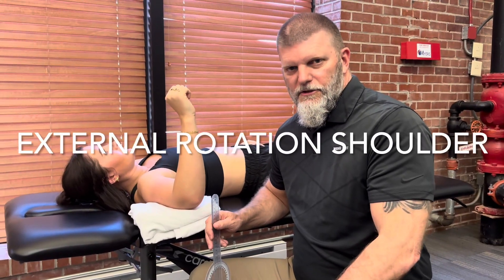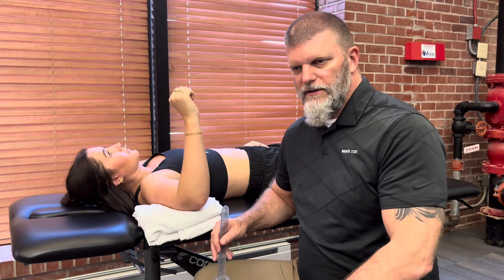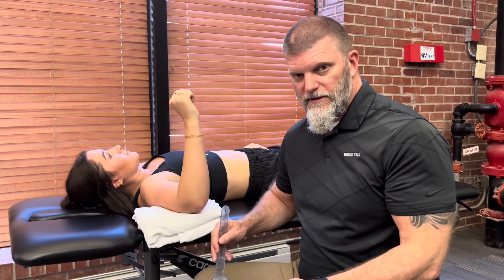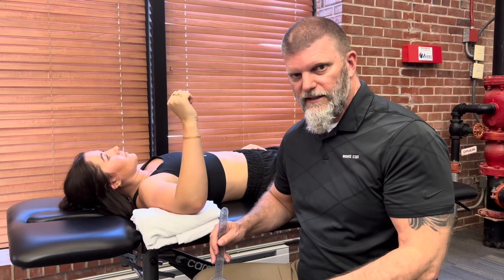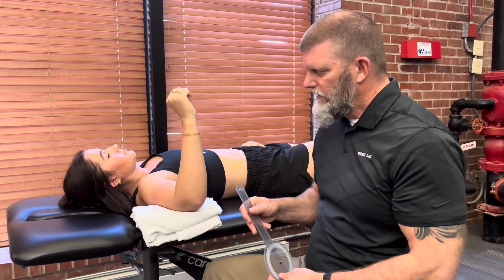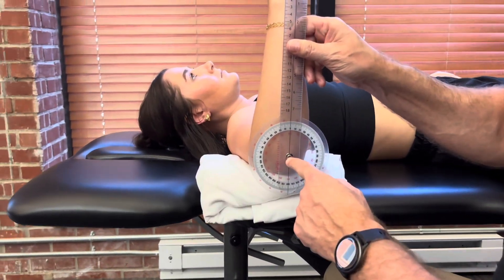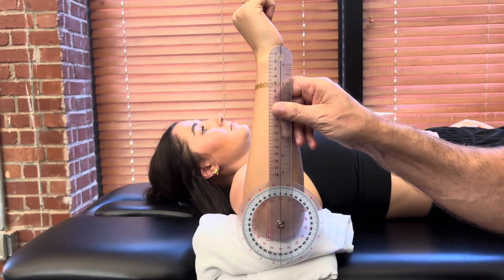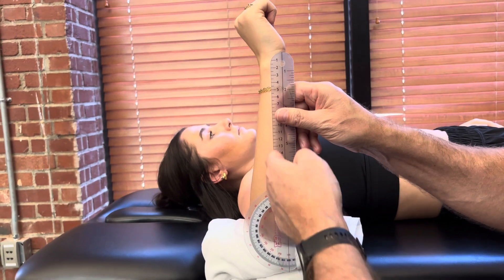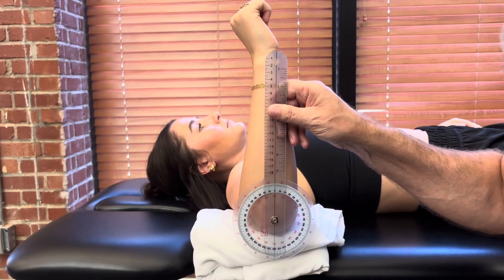Our next measurement is going to be shoulder external rotation. We'll do shoulder external rotation glenohumeral isolated and then we'll do total composite shoulder external rotation. My alignment is going to be the same. The axis is going to be on the olecranon process. The stationary arm is going to be vertical and the movable arm is going to be against the midline of her humerus.